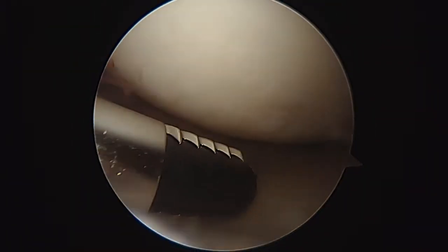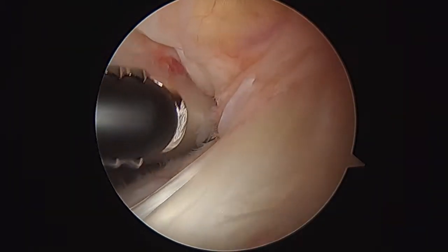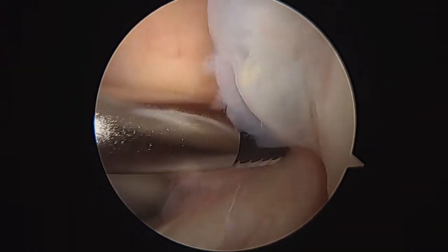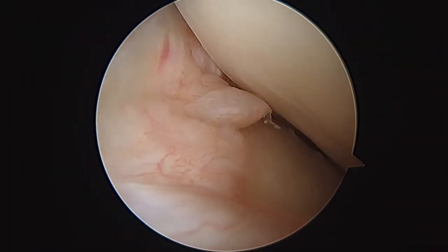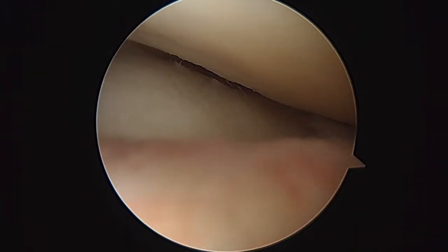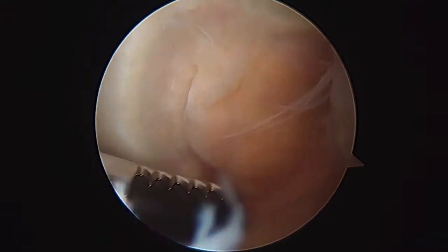I think we're done on the medial side. You can just see a little bit of wear and anterior changes on the condyle also. Now as we look in the notch, this is the anterior cruciate ligament — it's in pretty good shape there. In just a minute we're going to look over here on the lateral side, but I just wanted to show you this ACL and how good that looks.